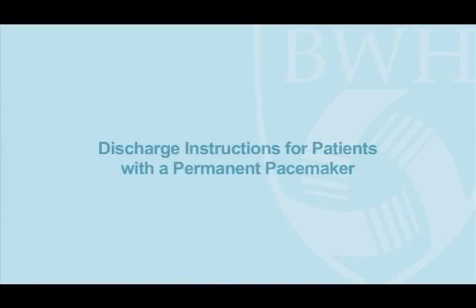In this video, we will discuss the discharge instructions for patients who have recently received a permanent pacemaker. You have had a permanent pacemaker put in. A pacemaker is a small device that prevents your heart from beating too slow. Having a permanent pacemaker means that you'll have to be aware of and do things a little differently once you get home. This video will show you what you need to know.